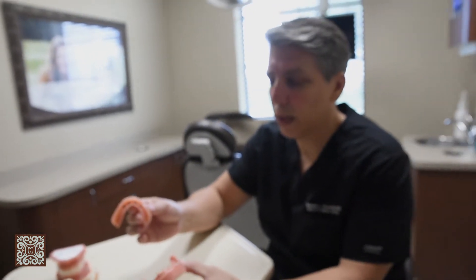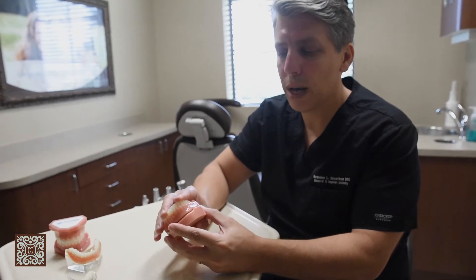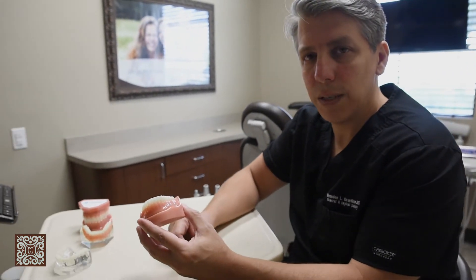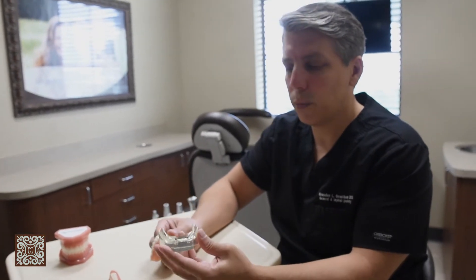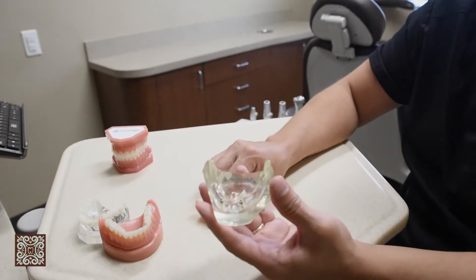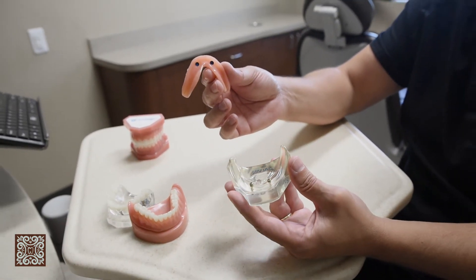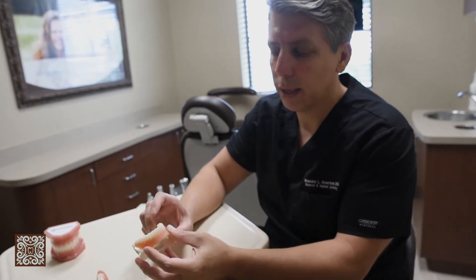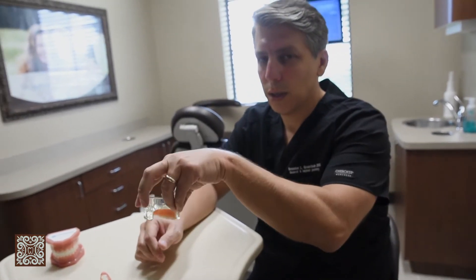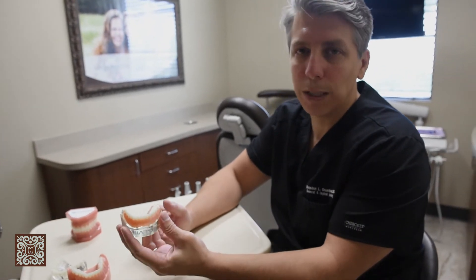They hold the denture in with these o-rings, and when the denture goes in the mouth, it snaps in place and there's no glue needed. Here's an example of a lower denture being held in by conventional implants — these are called locator abutments. They fit onto these o-rings inside the denture, and when you place the denture, it snaps in place and you can eat and chew without the denture moving around. No more glue.